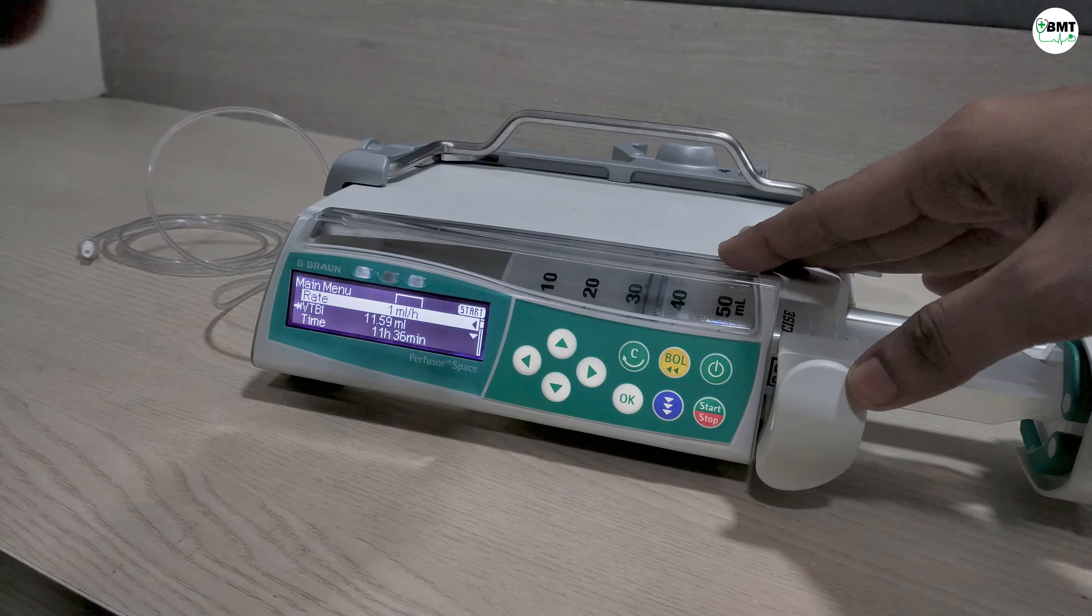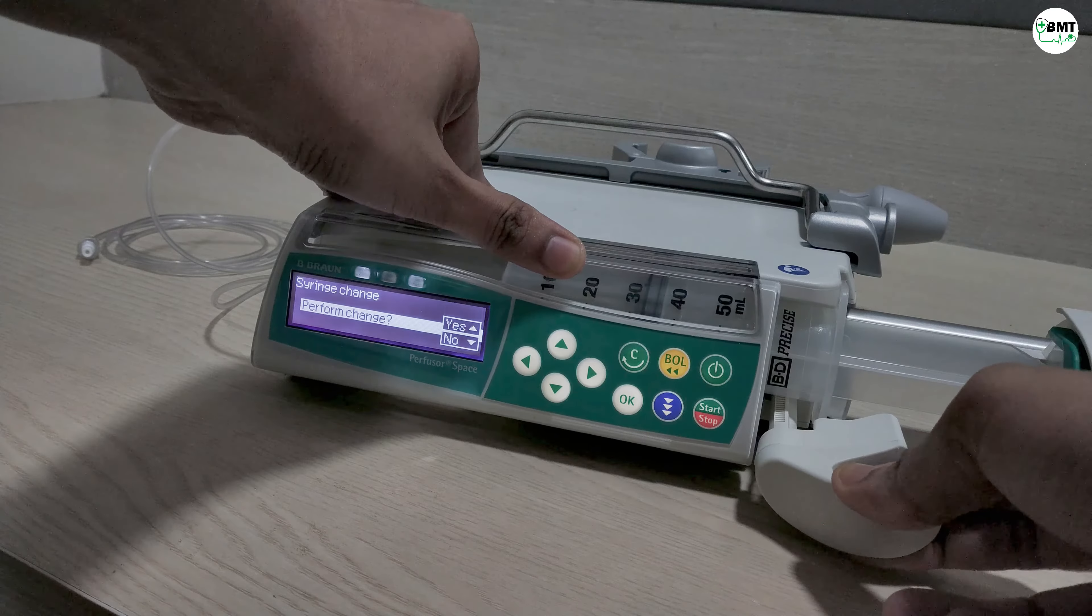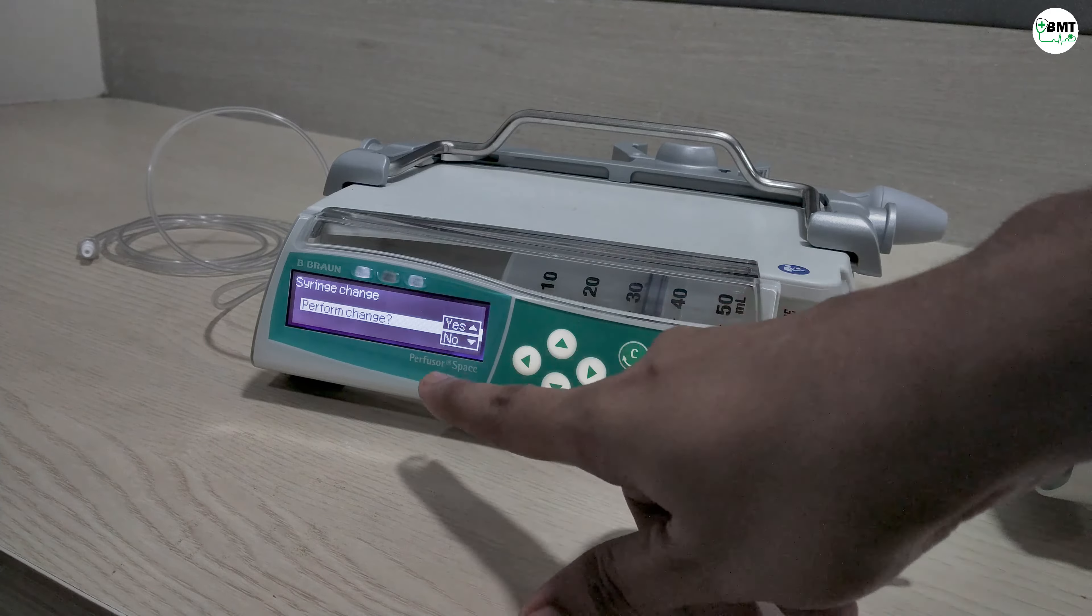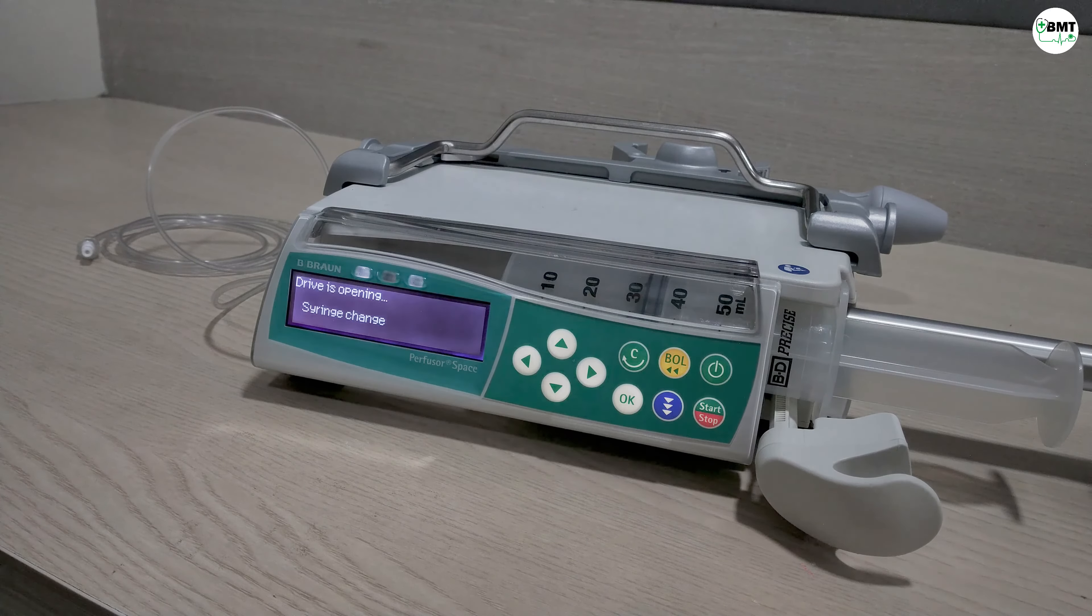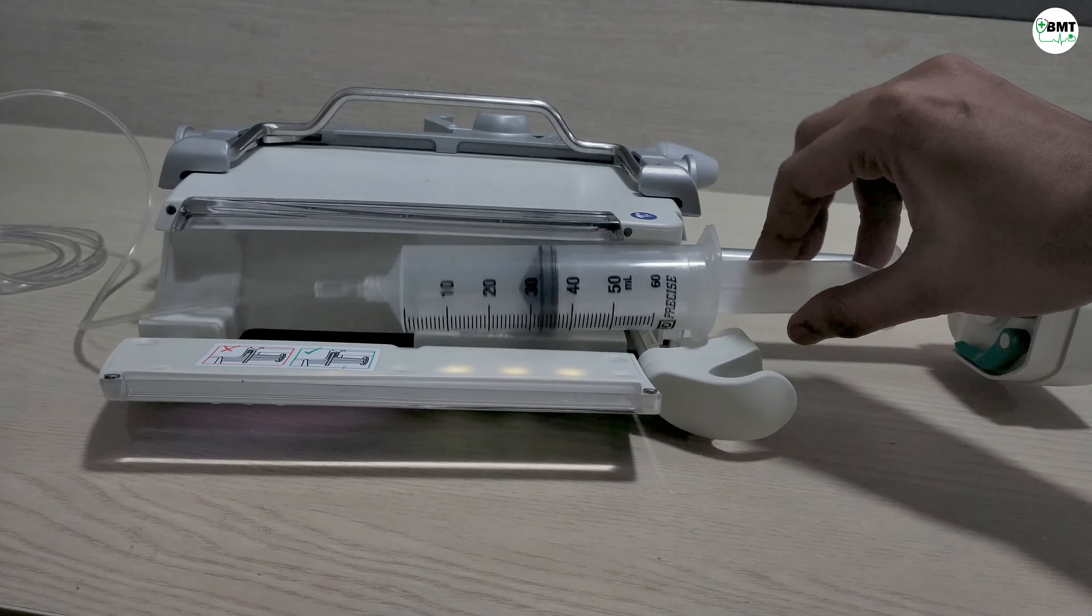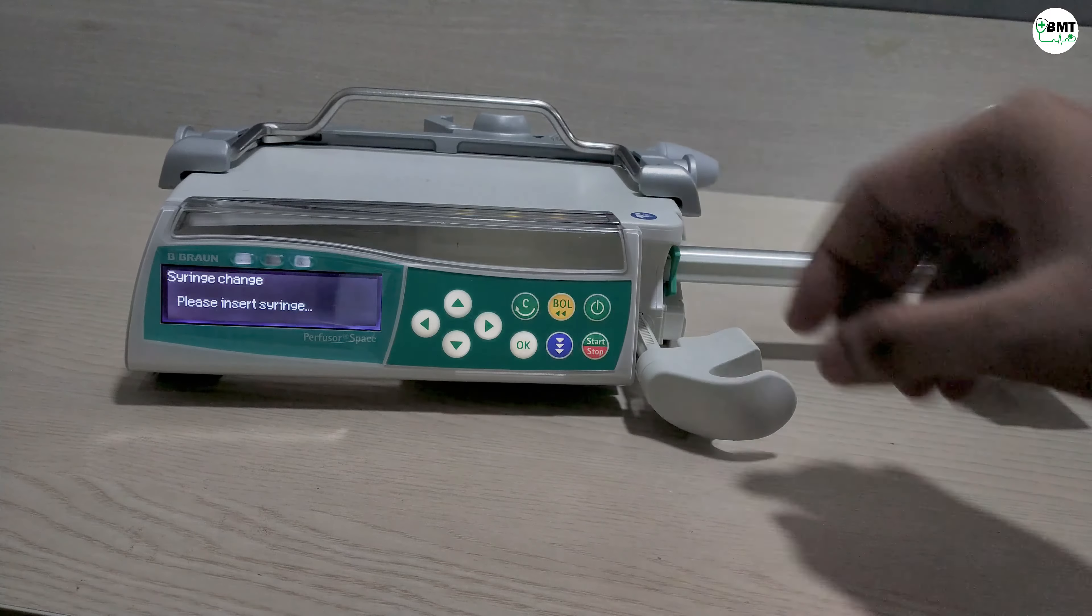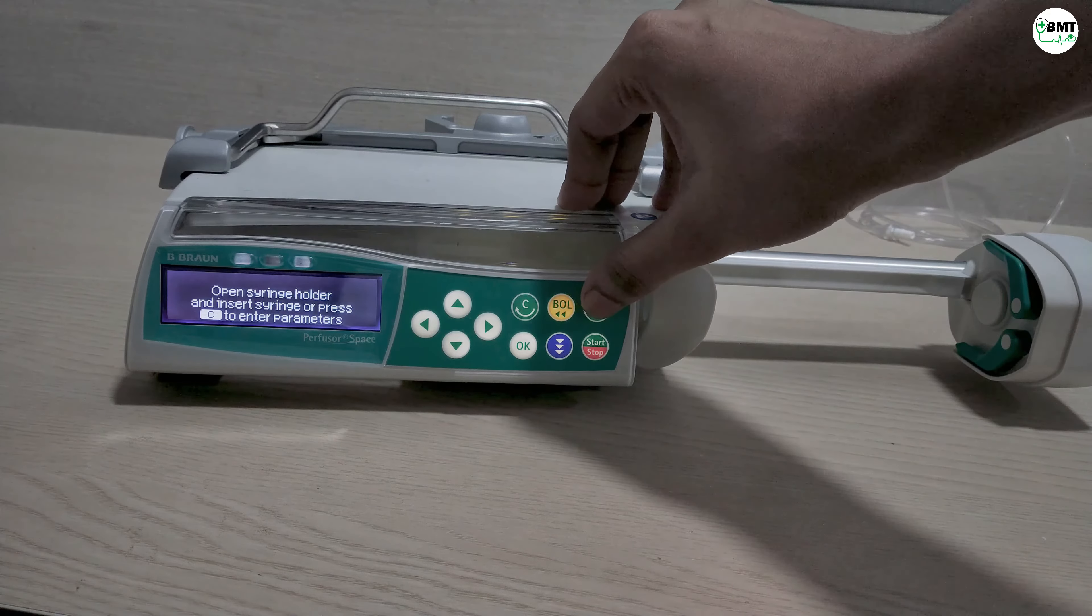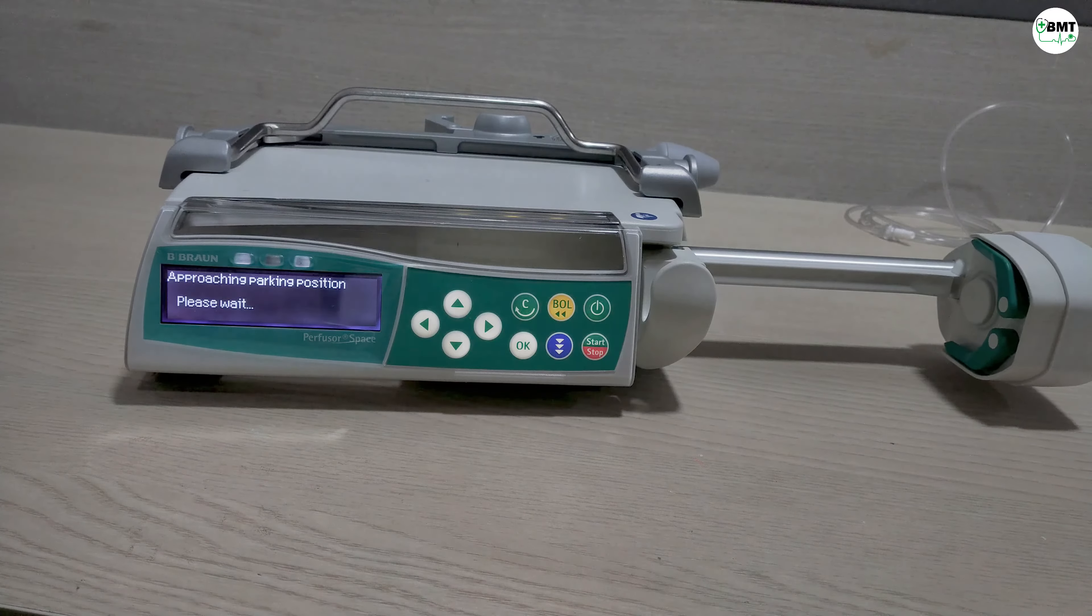Now if you want to turn off the syringe pump, pull this. It will ask perform change, yes or no. Yes. Remove syringe. Press on-off key for 3 seconds and the pump will turn off.